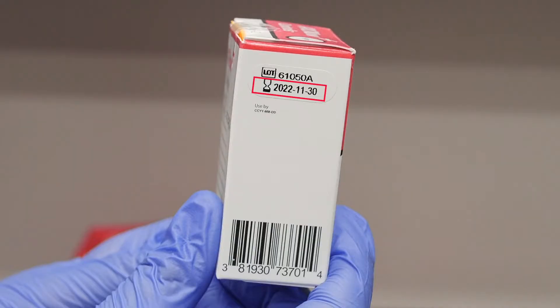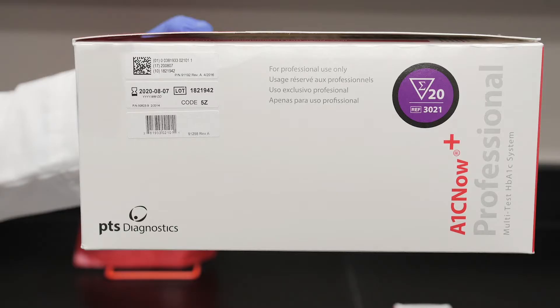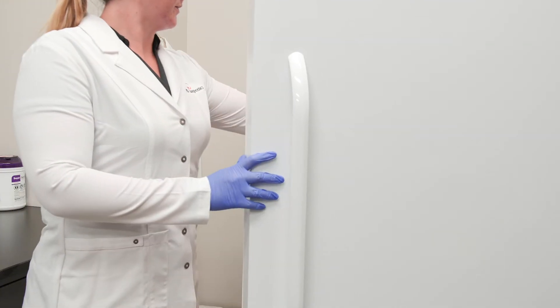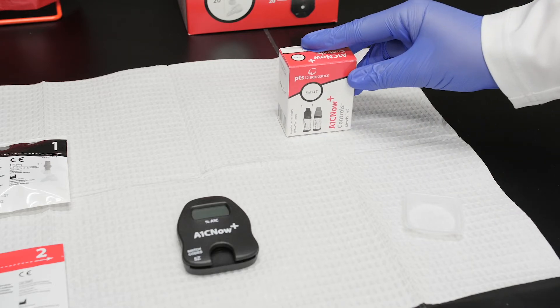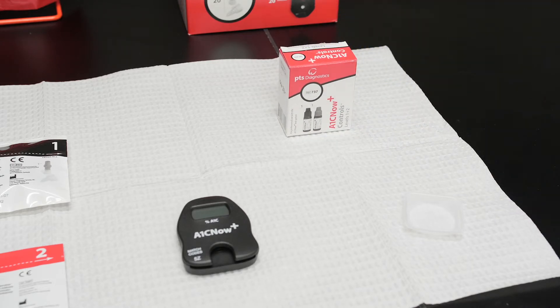Check the expiration dates on the A1C Now Plus Controls and the A1C Now Plus Test Kit to make sure they have not expired. If the control solution is frozen or refrigerated, allow it to warm to room temperature for at least 30 minutes with the cap on.